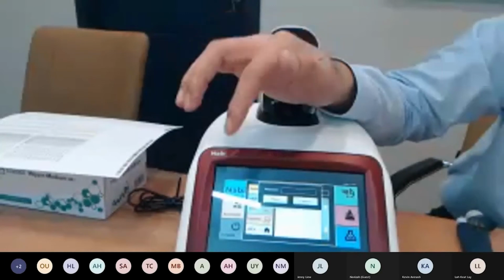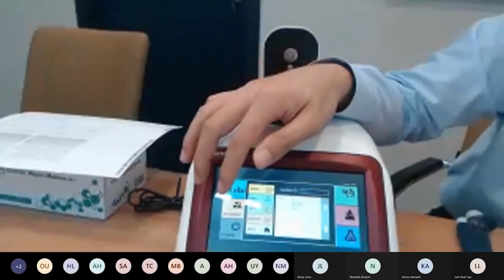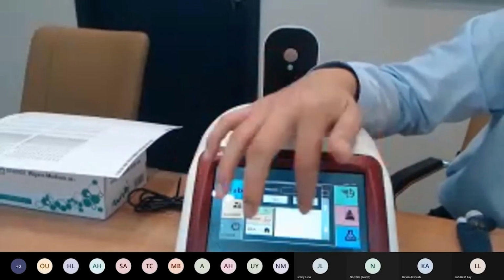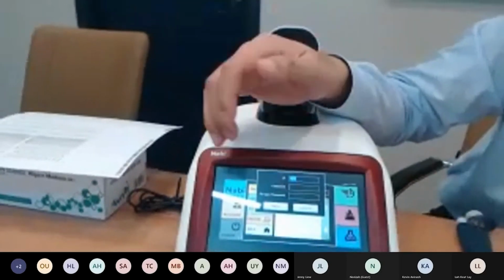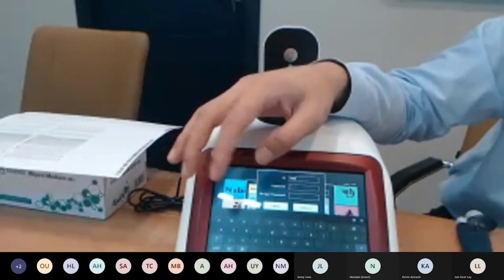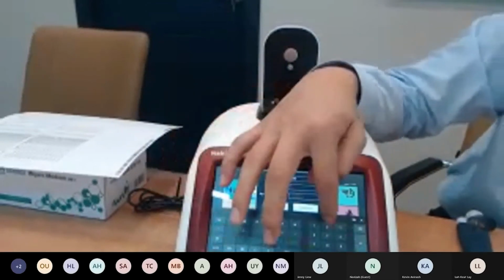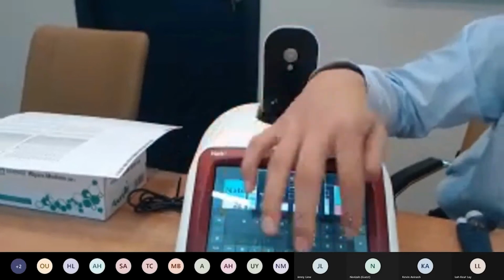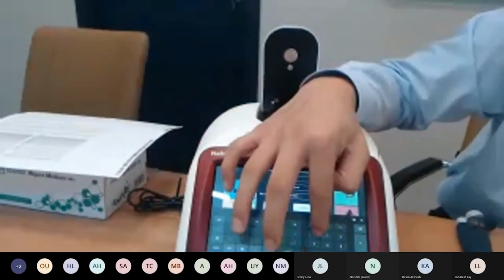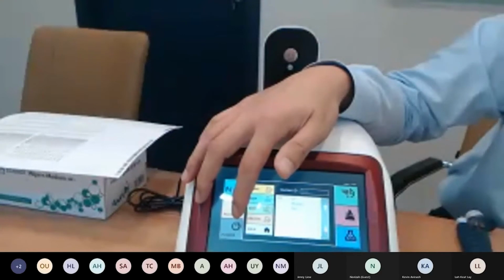If you want to swap to it, press swap. And since there's no password, just press OK and you've swapped. Or you can also edit an account. You can edit the name of the account by clicking edit. Since I didn't put a password last time, you can just enter a password you want. Let's say 1, 2, 3, 4. And retype the password. OK, and you have your password for the account.